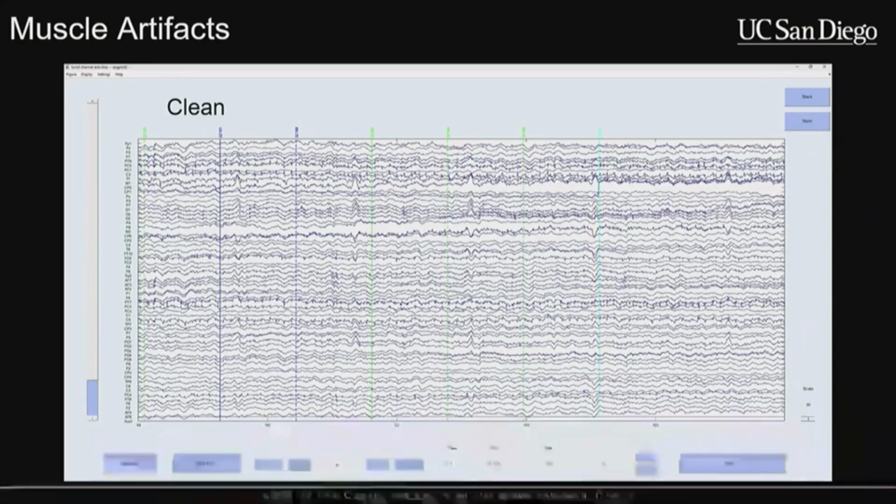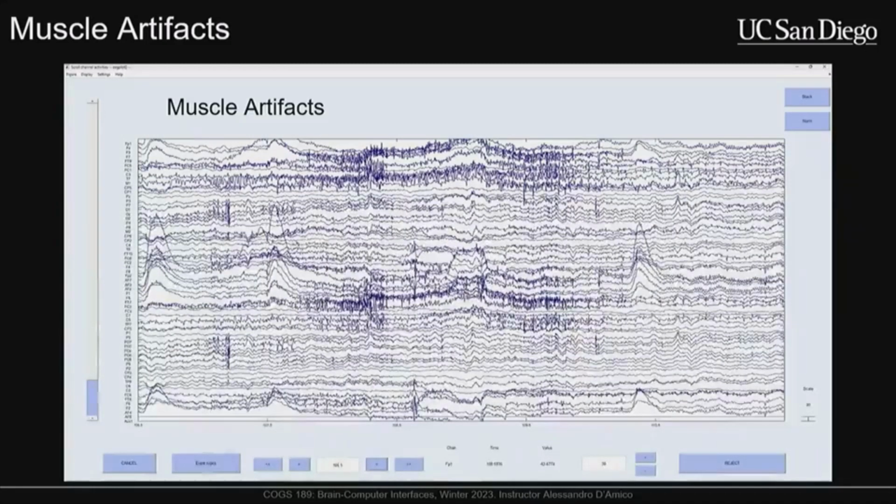And the participant is completing the task. Right after this last marker, which is that green bar, the experiment is going to go into a break. Well, they're going to get one more stimulus, and then they're going to go into a break phase. I've instructed my participants that when they're in a break, feel free to yawn or stretch. And so when the participant does that, we can see these. Hopefully it's obvious that this is very terrible.